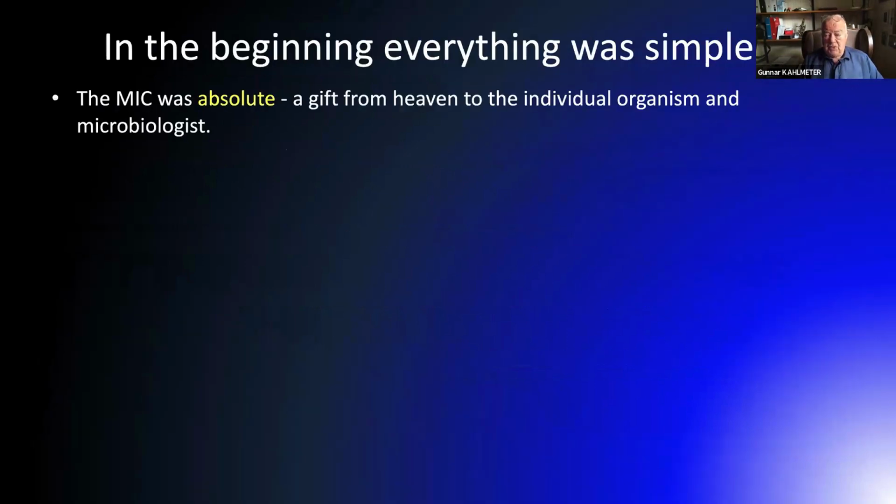In the beginning, everything was simple. The MIC was absolute. And I'm pretty sure that there are many colleagues who still believe that the MIC is an absolute mathematical value which can be compared to serum concentrations and that you can draw conclusions from. That is not the case. The MIC is a relative value which will change with whatever circumstances surround the testing.